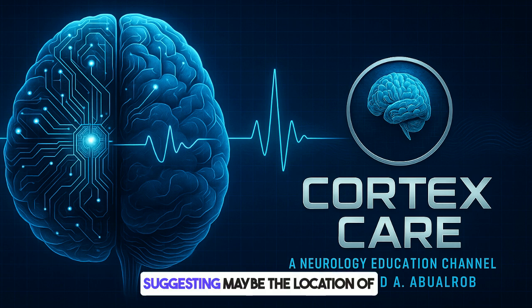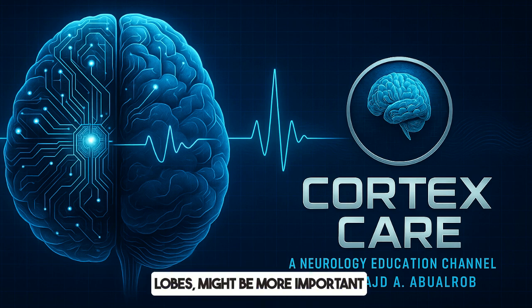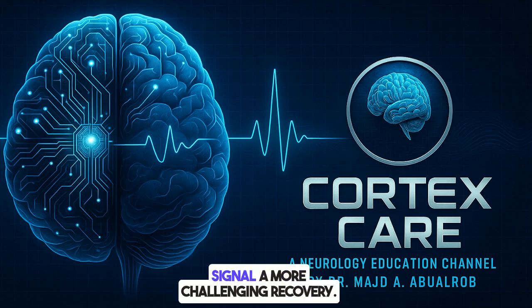How so? Suggesting maybe the location of the lesions, like frontal or occipital lobes, might be more important prognostically than just whether the MRI is abnormal or not. I see. So the pattern matters. Exactly. But despite the inconsistencies, the trend suggests significant MRI changes early on might signal a more challenging recovery. That could be important information.